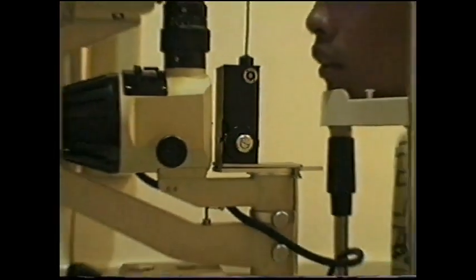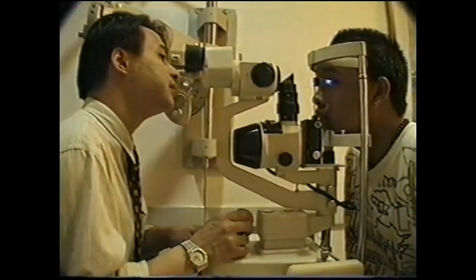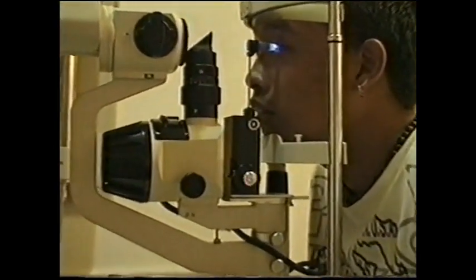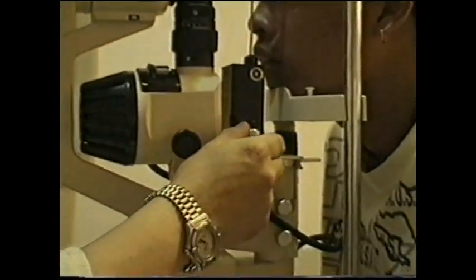Adjust the numbers on the tonometer force adjustment knob to read anywhere between 1 and 2. Instruct the patient to focus on your right ear, blink once, and then try to avoid blinking. Using the slit lamp control handle, gently move the biprism forward until it just touches the cornea. Looking through the slit lamp oculars, confirm that the biprism has just touched the cornea.